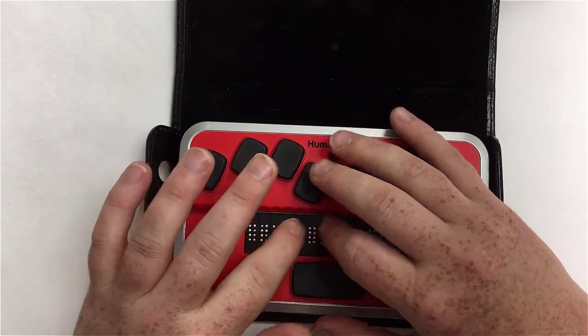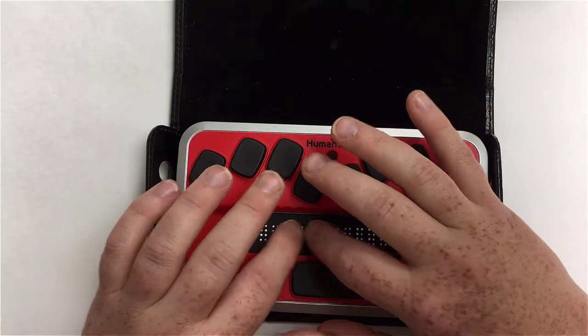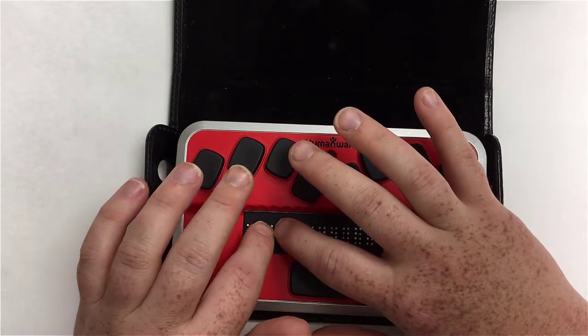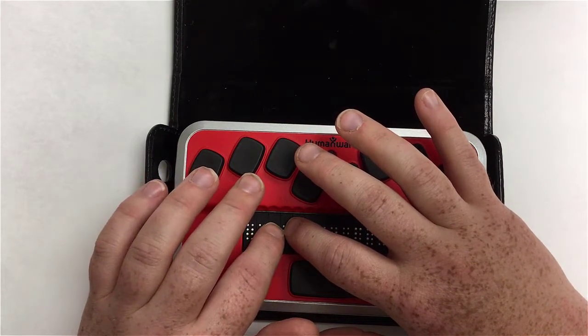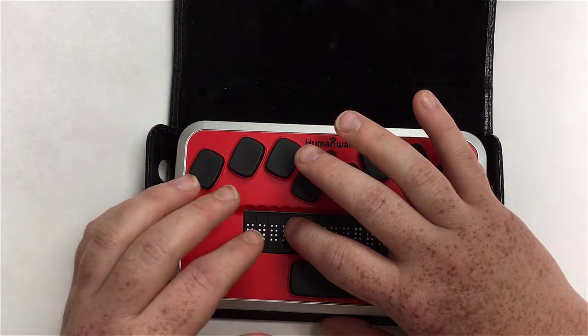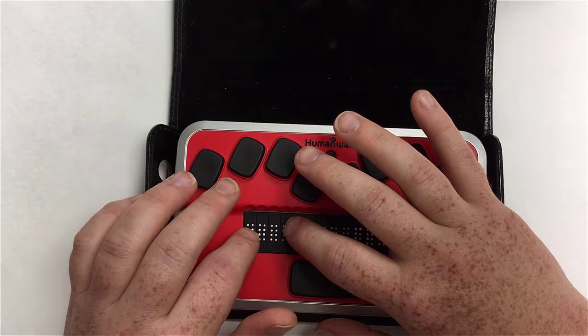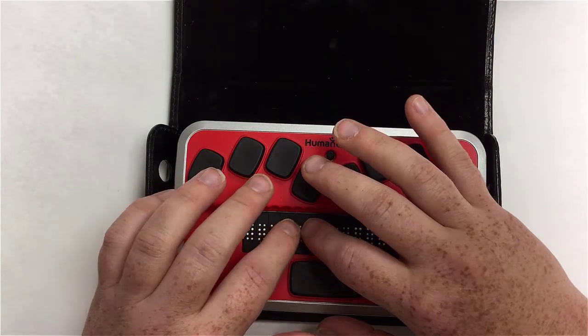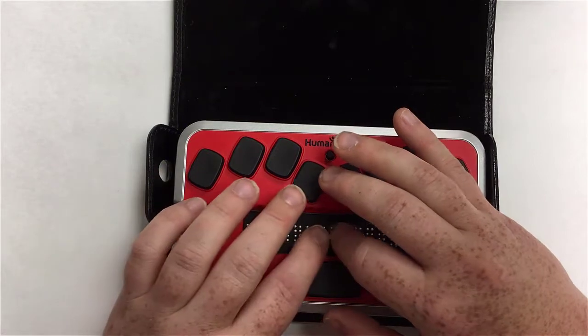It says 'starting' right on the Braille screen, and it only stays there about three to five seconds. Then you are redirected to the clock, which is part of the menu area. That is how you turn it on. We'll talk a little bit about the clock later.